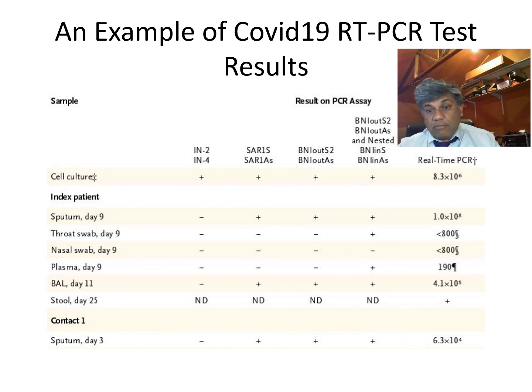This brings you to the current status of actually using PCR to detect coronavirus. Unfortunately, there's no established assay as such for coronavirus because it's a new virus. So what you might get in a clinical report is more like an R&D report, where the scientist and the clinician really have to sit down and work out what's going on, because the results aren't very clear from some of the samples. PCR is a very reliable process, but the problem is whether you're actually getting enough DNA in your sample, for example.